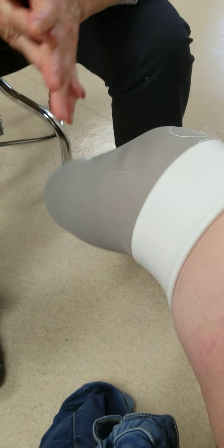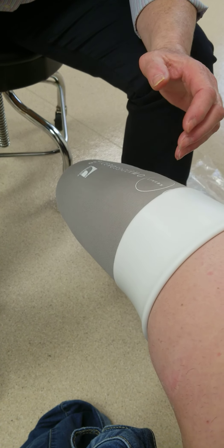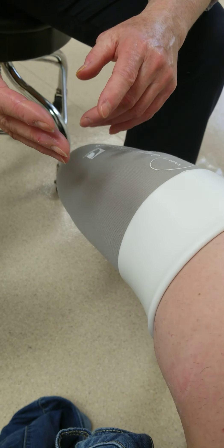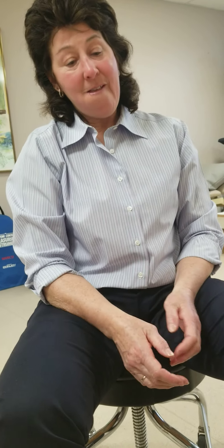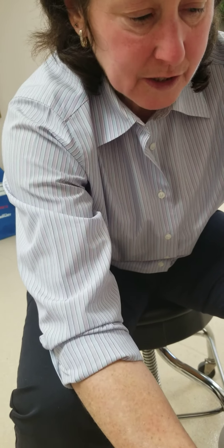That's the dermal liner — that feels much tighter. Not too tight, but this is the size you'd be in based on the measurements we just took. You're just shy of a 28; the sizes go 32, 30, 28, 26.5, 25. Since you're slightly smaller than a 28, we'd put you in the 26.5. I feel like I'm still shrinking some.